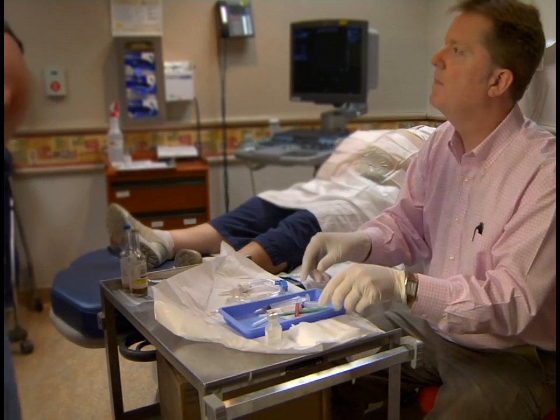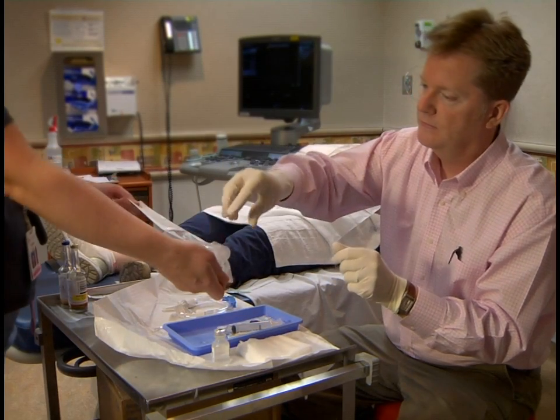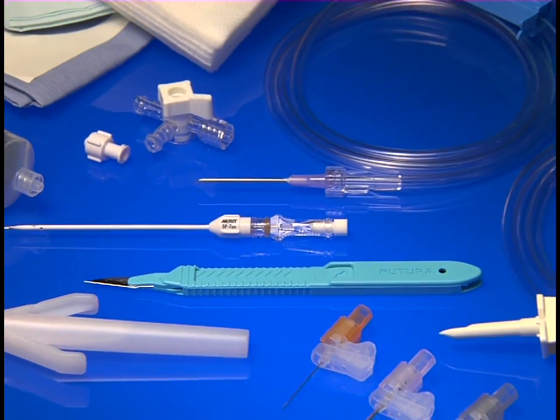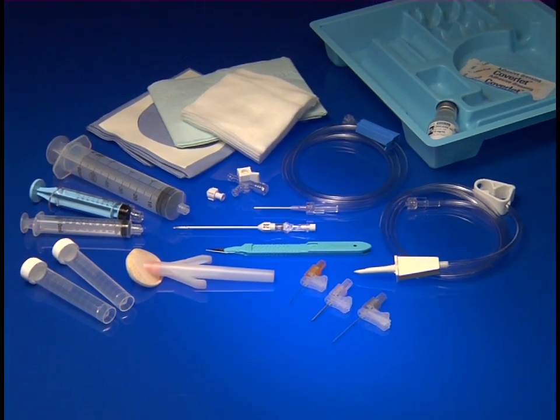Have you been in the middle of a procedure and had to wait while a forgotten item was placed on the sterile field? The TAPS has been designed to incorporate the necessary components for the Centesis procedure, minimizing the chance of procedure delays.